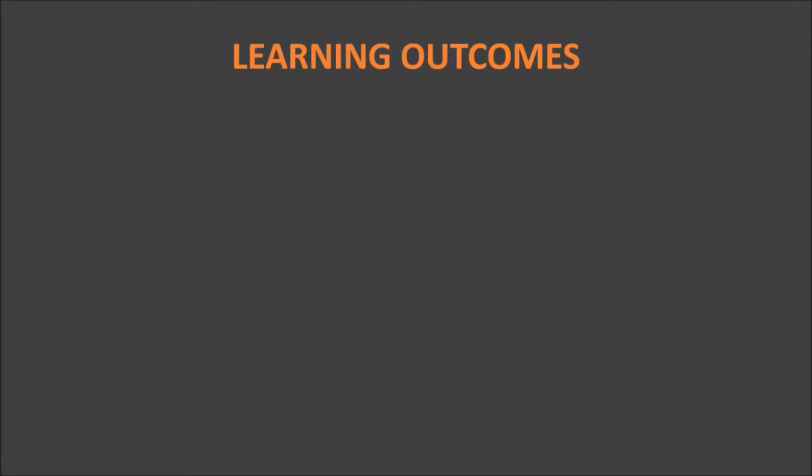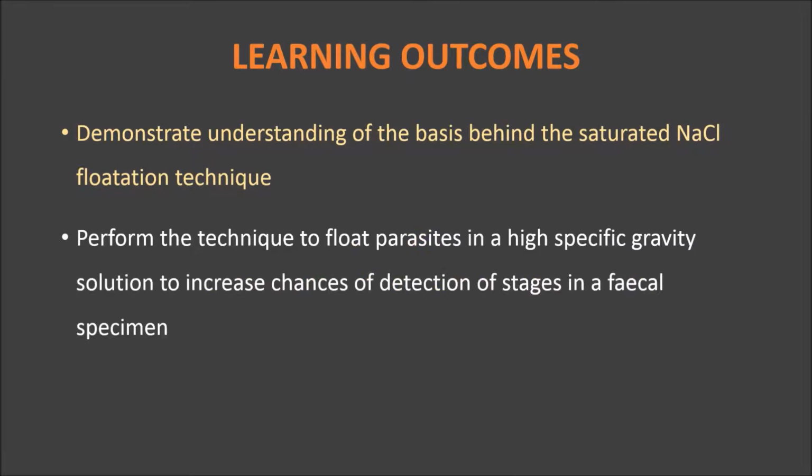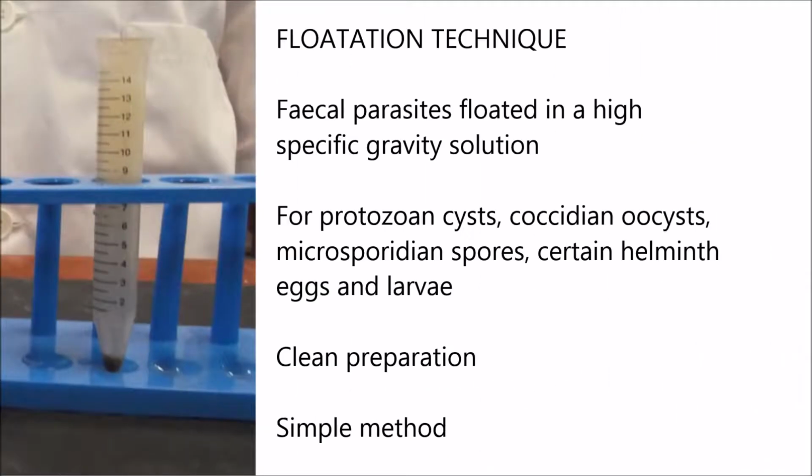These are the learning outcomes of this exercise. In the flotation technique, parasites in fecal samples are floated in a solution of high specific gravity. This procedure will permit the separation of protozoan cysts, coccidian oocysts, microsporidian spores, and certain helminth eggs and larvae.